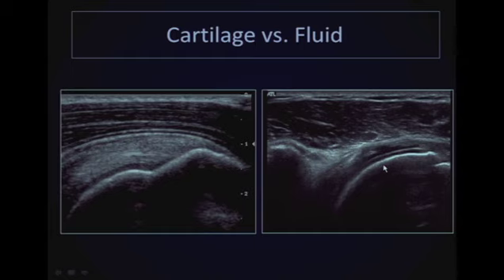In this case, we can see that we have the skin and subcutaneous fat, the deltoid, part of the rotator cuff we do not see, and then we have the humeral head with a cartilage cap. And you can see that where the fluid is overlying the cap, you can see the surface of the cartilage. And so you know that this is not part of the fluid. This is a normal structure, and then we do have fluid here. This is a full thickness rotator cuff tear.